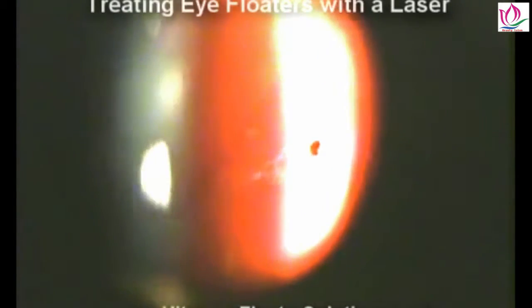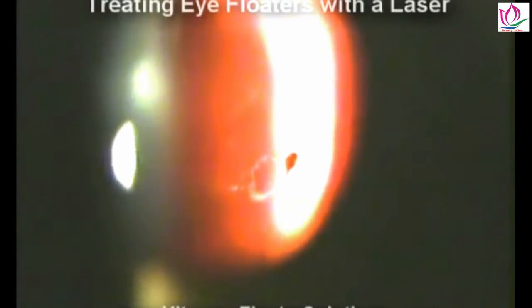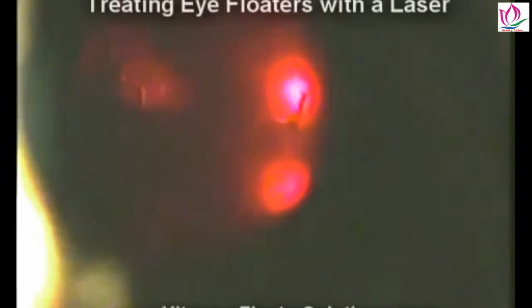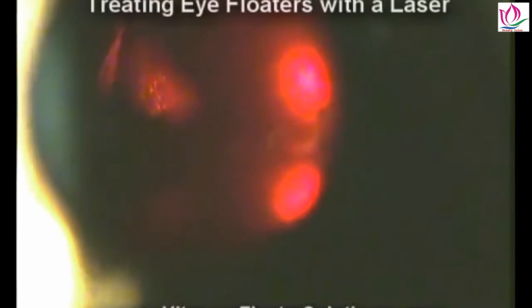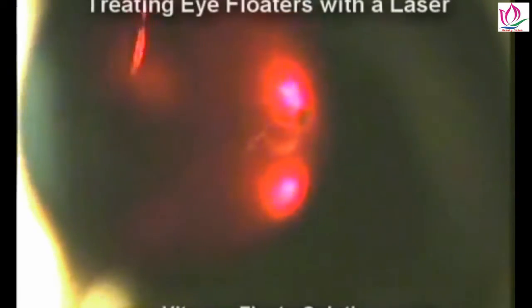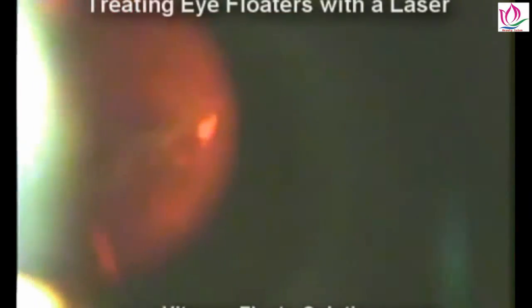So here's what that ring looks like to me looking through the optics of the laser. And these are difficult to photograph, but as I swing my light source back and forth, you can appreciate a ring-like structure. And the bright red lights in the background are the overlapping red focusing beams. And occasionally you'll see those red beams kind of light up on the surface of that ring-like structure. And that's what I use to focus.